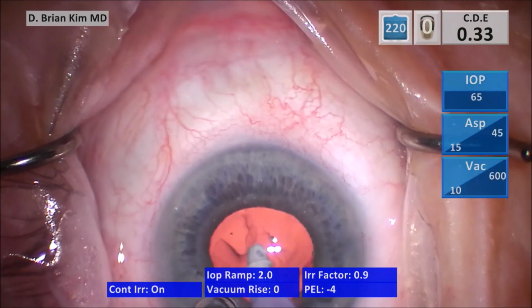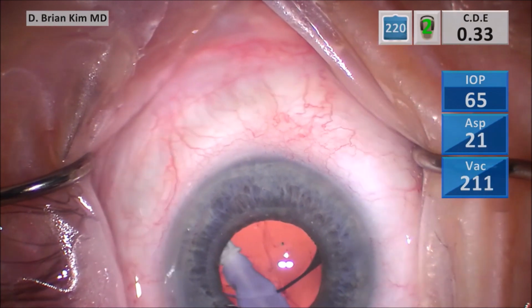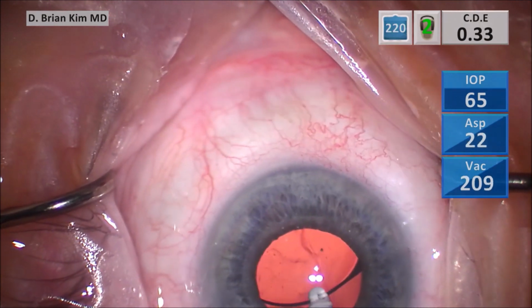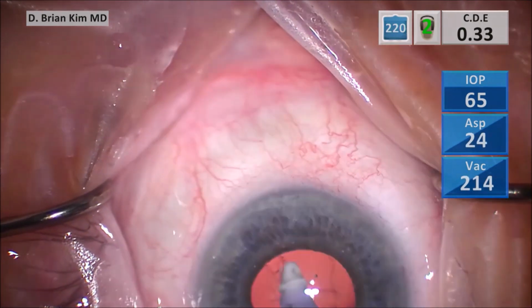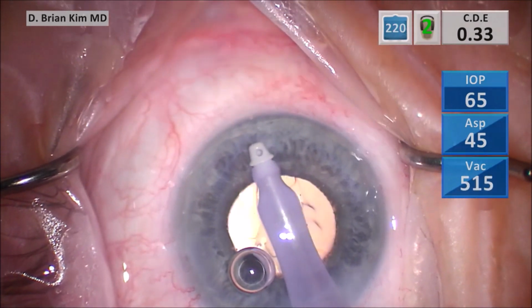So I'm going to remove my viscoelastic. I go in with irrigation off because I don't want to, again, push fluid against Descemet's and strip Descemet's. And I remove viscoelastic from underneath the lens and also in the anterior chamber. And then I hydrate my incisions.